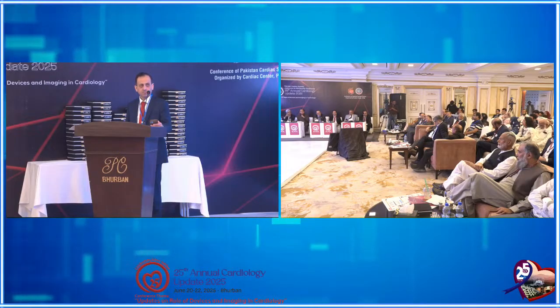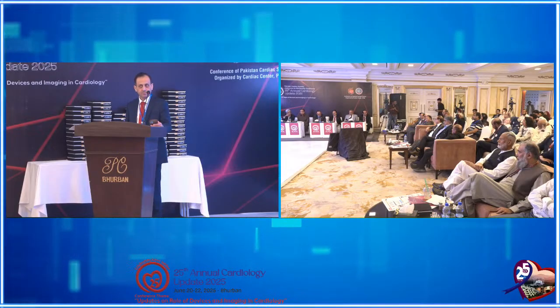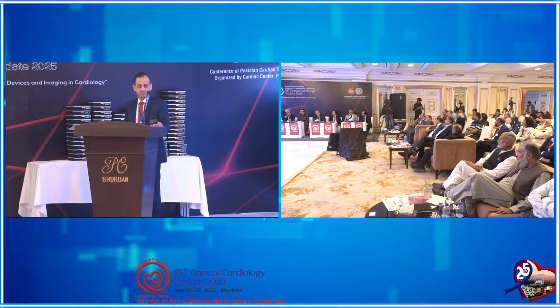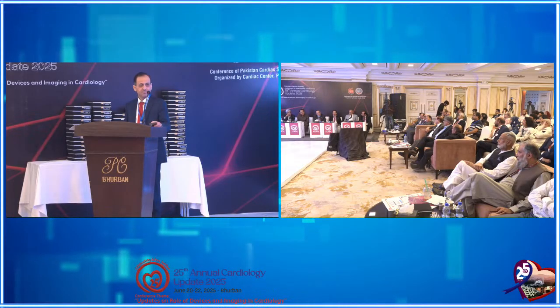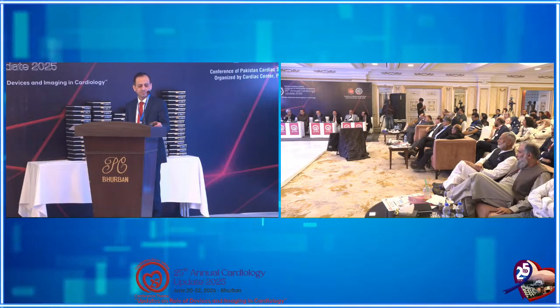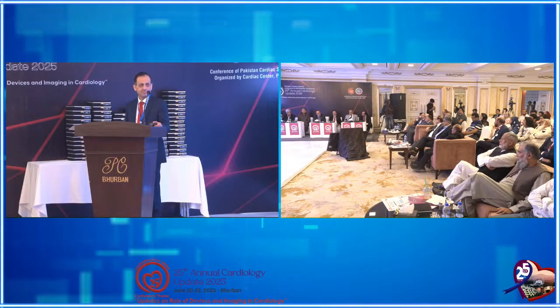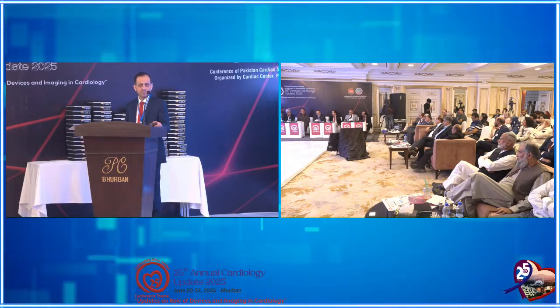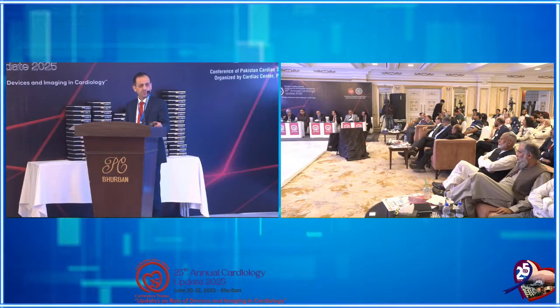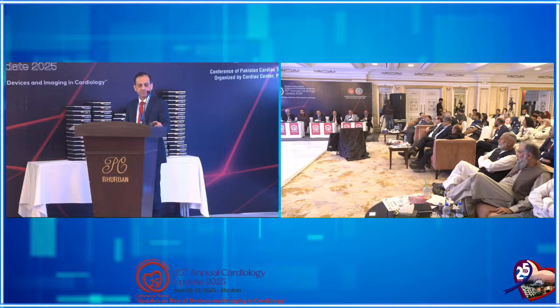And one of the reasons they thought was because आप टिप से करते थे, तो टिप फ्लेक्सिबल होती थी, तो आप उसको मोड़ मोड़ के करते थे, तो एडिक्वेट रीनल डिनर्वेशन नहीं होती थी, जिसकी वजह से ये ख्याल था. तो then they made a new catheter and उनके साथ जो ट्रायल्स आए हैं, they are very promising. That's why now it is approved and being used.